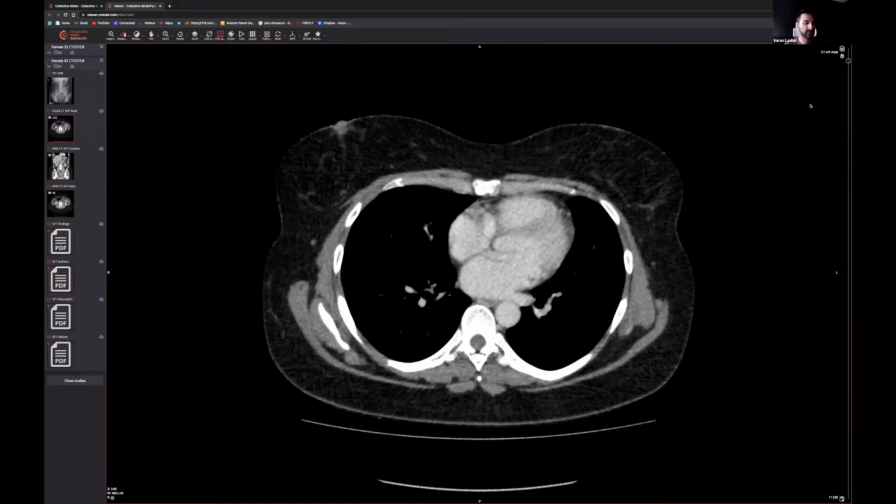So they're going to have Crohn's, but if someone's got Crohn's, why would you do a CT scan? The reason is that they're also predisposed to perforations. The inflammation can result in fistula, so connections between bowel. You can get fistula between the bowel and the skin, or between bowel and the uterus. You can get connections between places as a result of the multiple inflammations, which CT is very good at looking for.